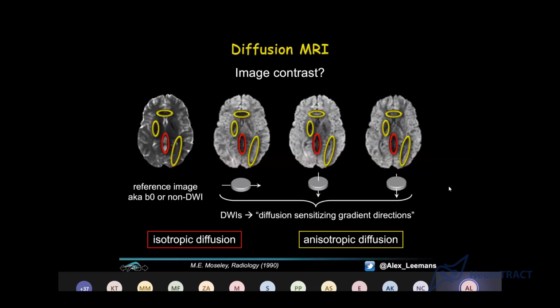Okay, so in practice nowadays, we would be acquiring more than 3 diffusion weighted images. We would be acquiring even 60 or more orientations, diffusion gradients. And obviously, the law of conservation of misery, right? The more you want to know, the better data you want to have, the more time it will take to acquire all these data. And obviously, there are limits to it. Lying in the scanner, maybe half an hour max, maybe an hour, really pushing it, is the amount of time a person can lie in the scanner with comfort. Let's call it that.